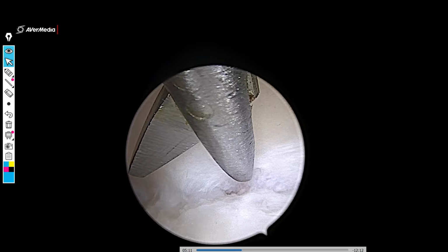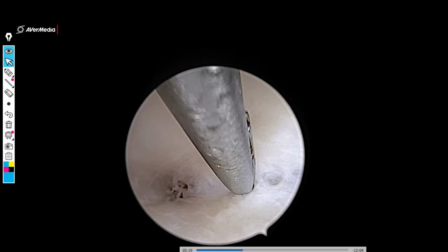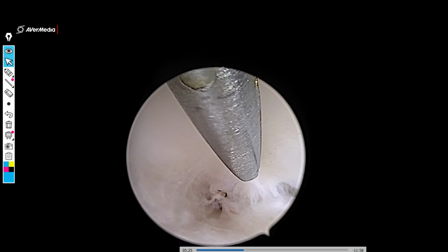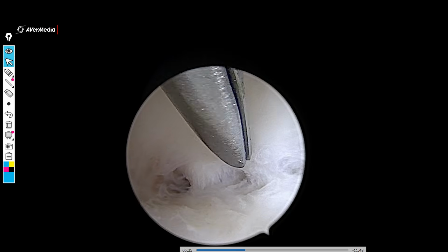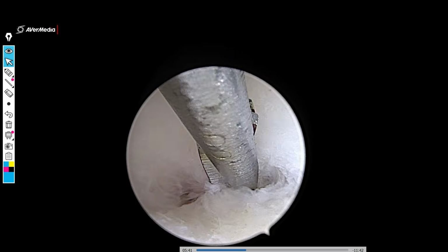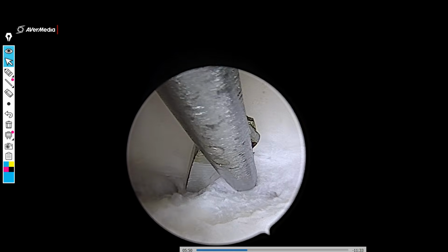And we are using a distension pressure of between 120 to 150, particularly in cases of severely T-shaped uterus and synechia. I prefer to keep a slightly higher distension pressure, maybe up to 150 or 160 even, for the simple reason that this higher distension pressure causes the walls of the uterus to move away. When there is no fibrosis, it is okay, the walls can move away even with less distension pressure. But with significant fibrosis like this, it makes it difficult to cut unless the walls have been separated well. And so I use a slightly higher distension pressure.